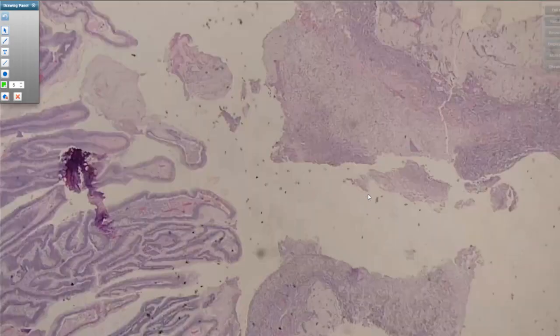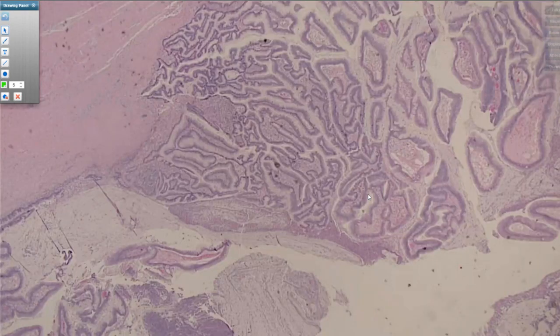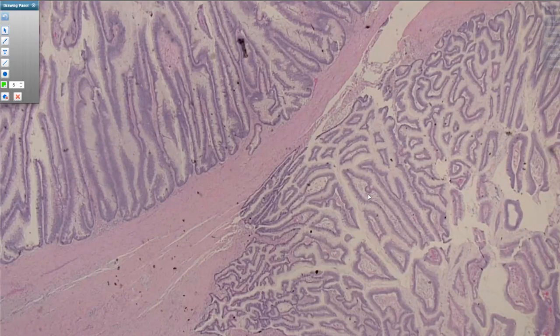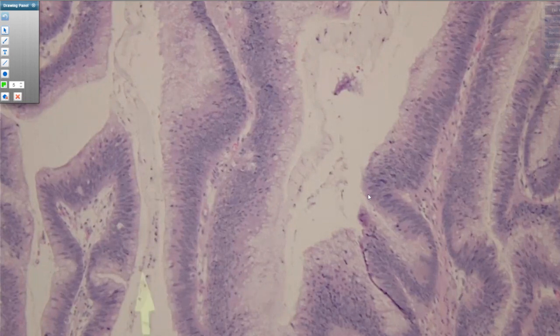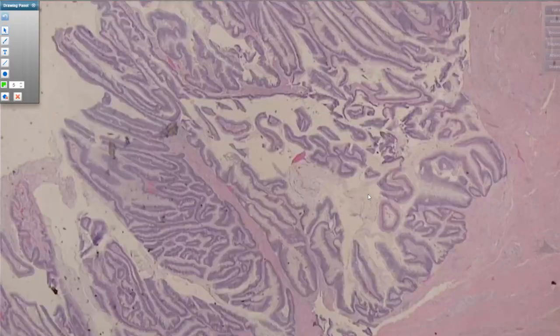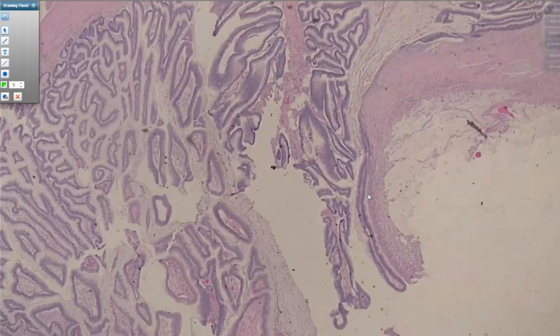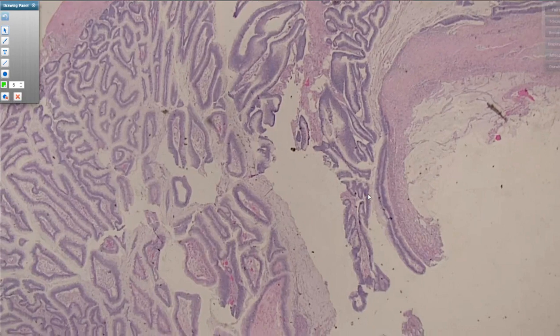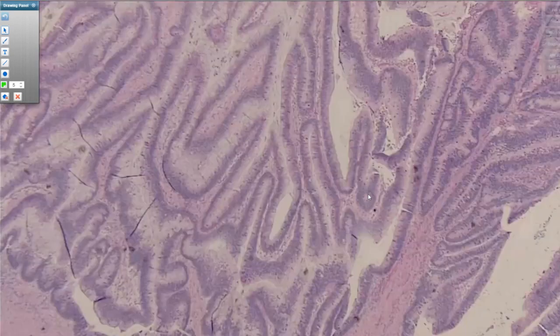We classify them based both on the degree of dysplasia and on the histologic subtype. So we define low/intermediate and high-grade dysplasia. In low to intermediate grade dysplasia, you still have general organization of the cells, where they may become pseudostratified, but they still line up neatly, kind of like a picket fence here at the bottom. You don't have total loss of polarity. You don't have any architectural complexity like cribriforming or micropapillary formations. To contrast that, when you get into high-grade dysplasia, you really want to see both cytologic disarray, where you have markedly atypical cells that have lost polarity, and you also would like to see architectural disarray in which fronds become fused, you see cribriforming, and you see maybe micropapillary features.